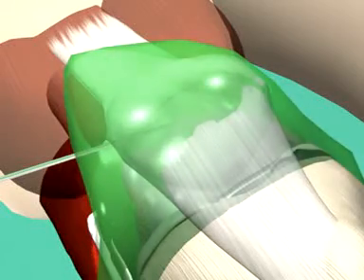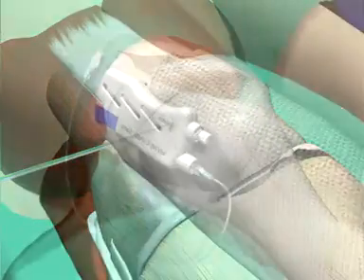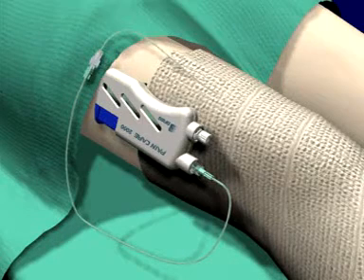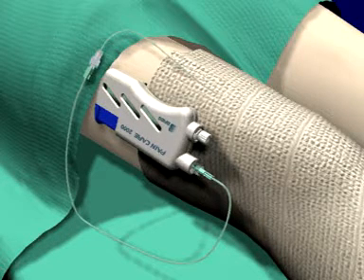The patient must be instructed to push the button once every 4 to 6 hours. Once the dressings are applied, attach the PainCare using the metal clip to the dressings, brace, or sling.